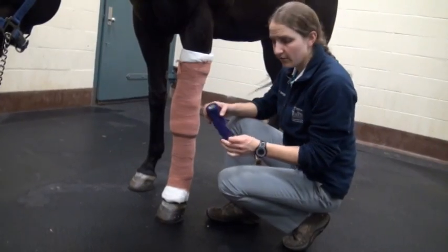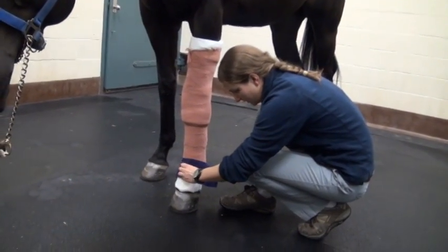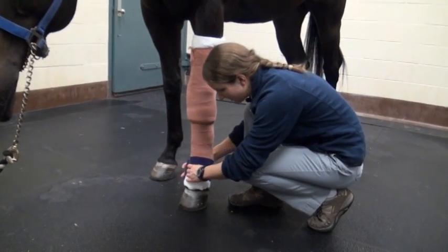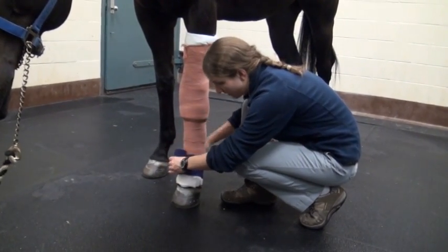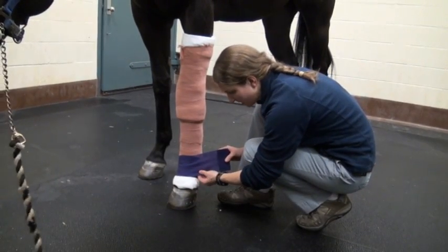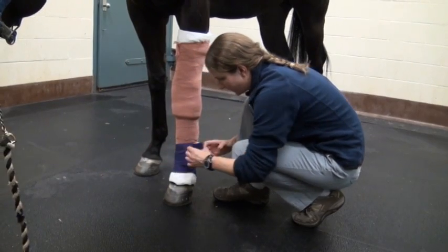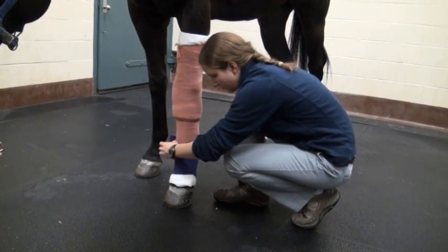The next layer of your stack wrap will be your vet wrap. And this can be applied directly over your brown gauze. I typically start at the bottom and work my way up. With your vet wrap, you want to stretch it so some of the inherent wrinkliness is gone, with about 50% overlap with each layer and nice even pressure.